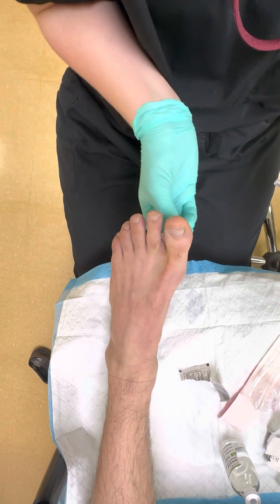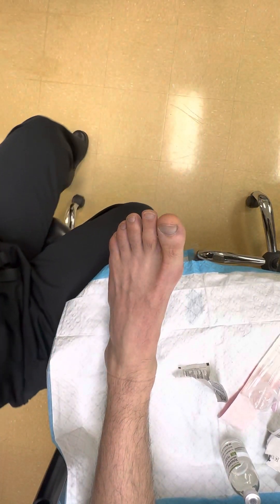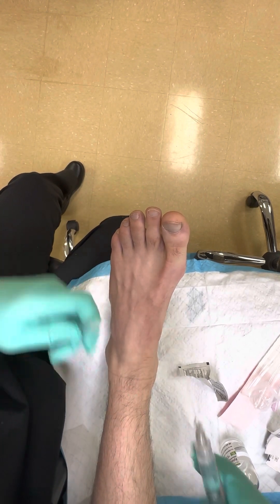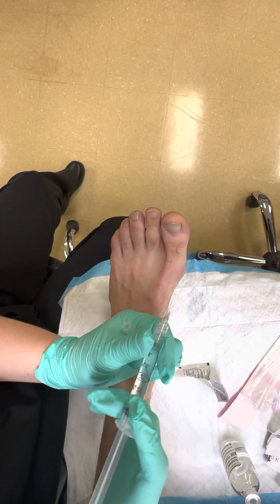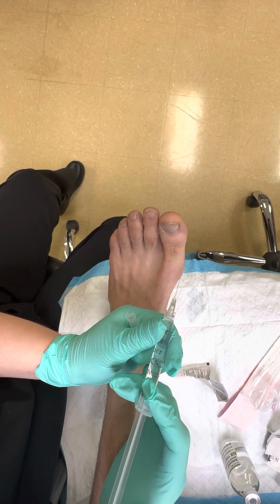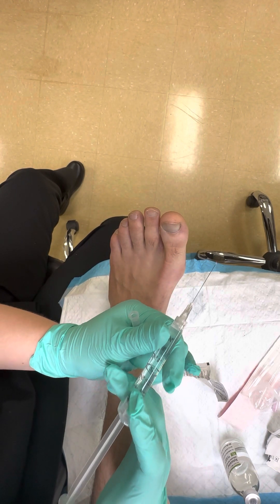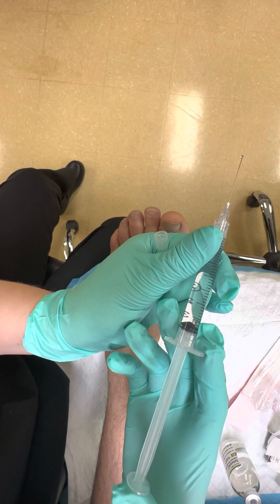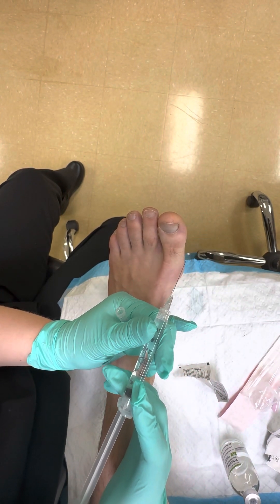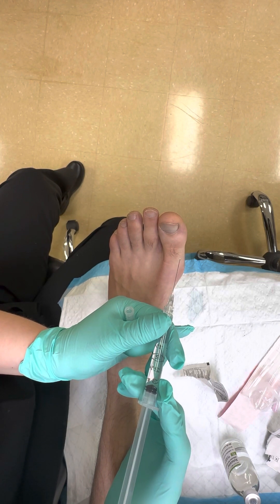I like to position myself with my back facing the patient and my hands on the patient's lower extremity, so I have control if they move. Notice how I hold the syringe — like Spider-Man — and I use my non-dominant left hand to hold the toe in place just in case the patient moves. Patient, are you ready? Yes — awesome.